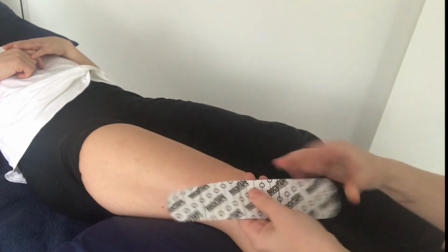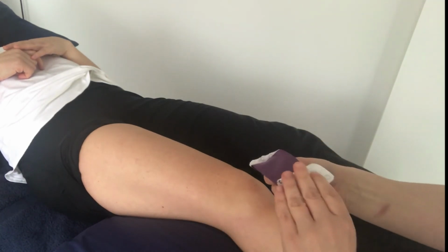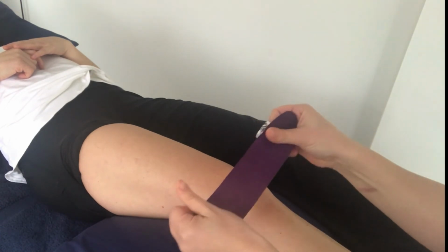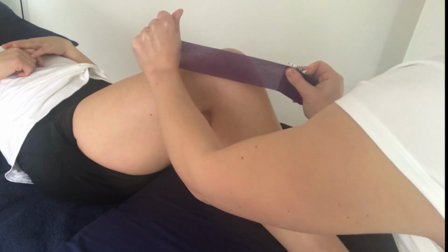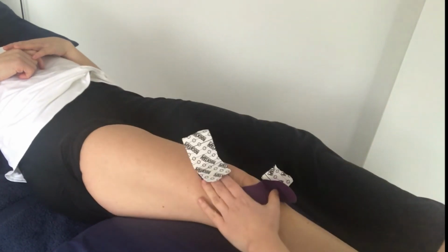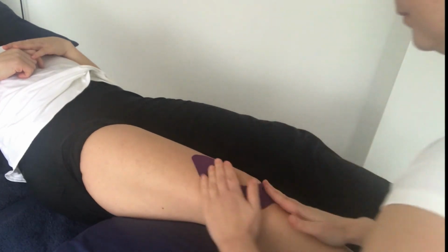Focusing on the lateral part of the knee with the client supine, we take the tape and break off in the center of the paper. And then with the client's bent knee, take a heavy tension of the tape, and the tape is applied inwards towards the patella. Rub the center of where it's been attached, straighten out the leg, and then add both anchors and rub the tape to stick down.